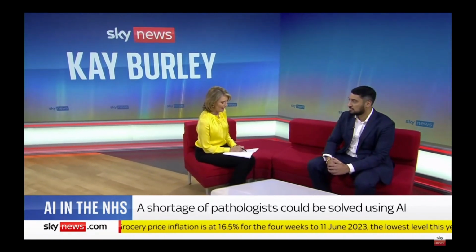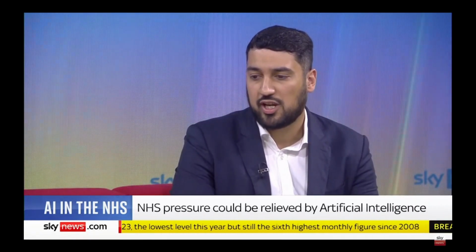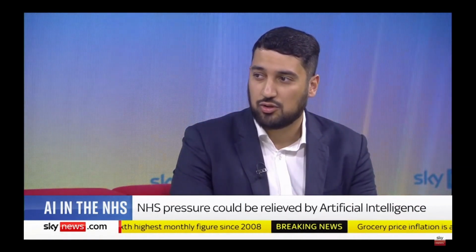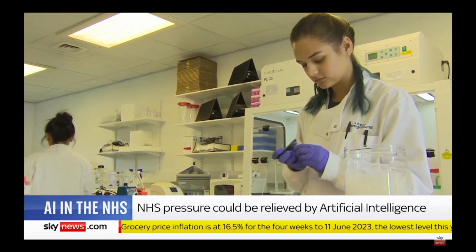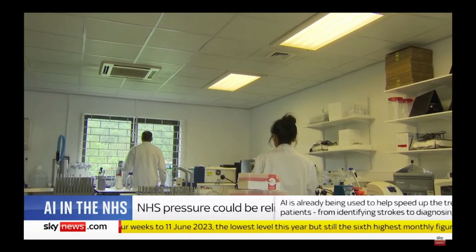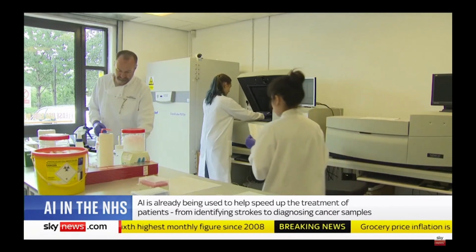So AI is a possible help here. How would using AI in cancer pathology work? So we have changed the conventional way that we do pathology. Traditionally, you'd look through a microscope at some slides to try and look for changes in structure, to identify cause and effect in diseases. And what we've been able to do over the past few years is take that slide image, put it on the cloud, allow any doctor anywhere in the world that is qualified to be able to provide a diagnosis. The add-on from that is artificial intelligence.